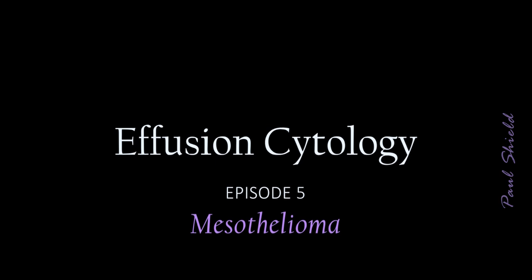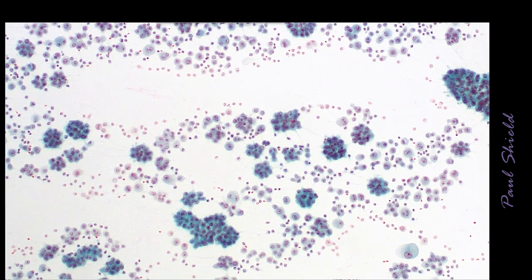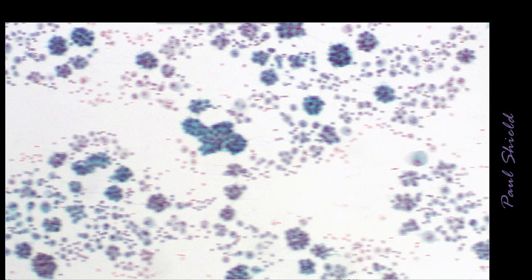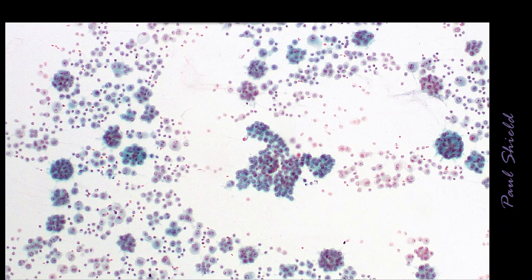So this can be quite a tricky diagnosis. What we're going to look at is the most common pattern, which is pretty much a well differentiated pattern of mesothelioma. Specimens are usually highly cellular, so looking down here I can see lots of groups, and notice they're slightly complicated. So this one's branching a little bit like a sort of X, and then lots and lots of balls of cells. So highly cellular, large groups of more than 50 cells.